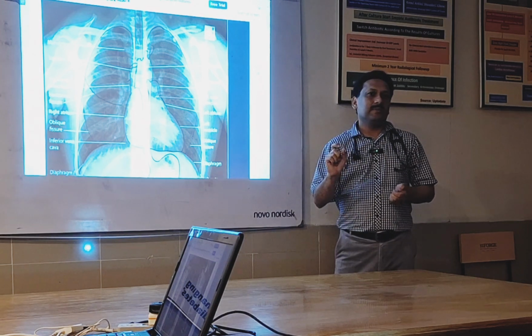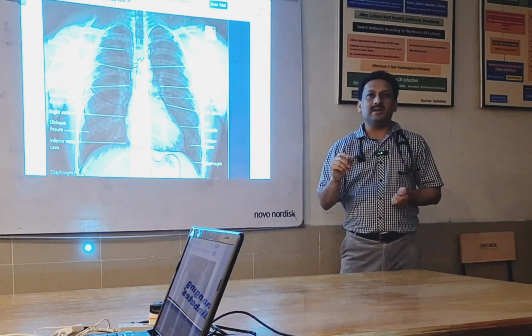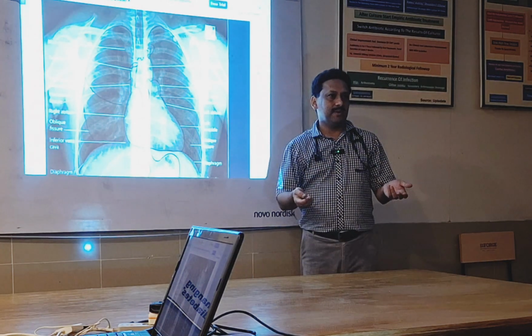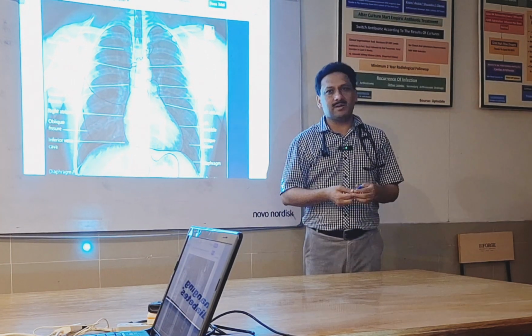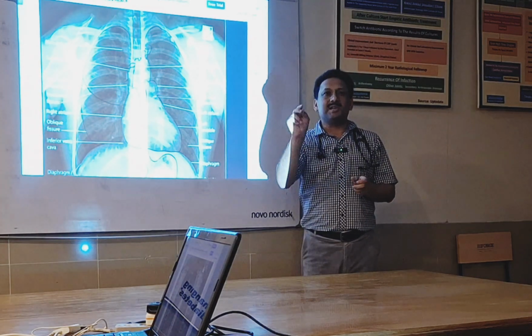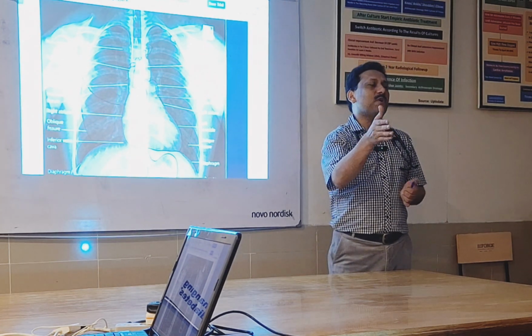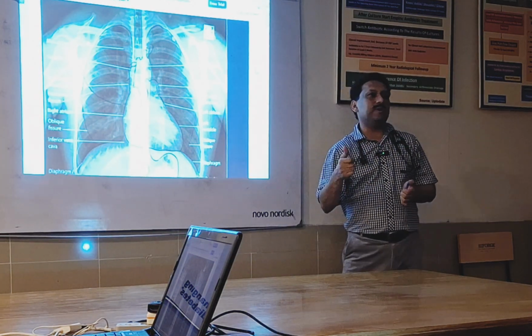Now we move on to the major thing, and that is you want to see each and everything. You do not want to forget anything. For that purpose, you just need to remember one mnemonic: A, B, C, D, E, F, G, H. It's such a simple mnemonic. A for airway, B for bone, C for costophrenic shadows, angles and cardiac shadow, D for diaphragm, E for equal volume, F for fine details, G for gastric bubble shadow, H for hilum.